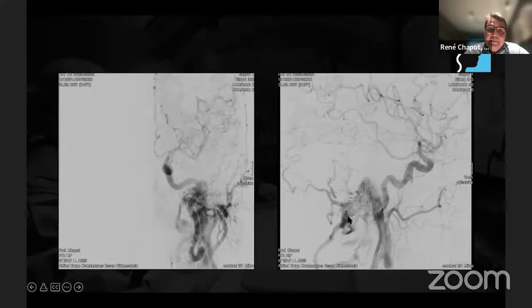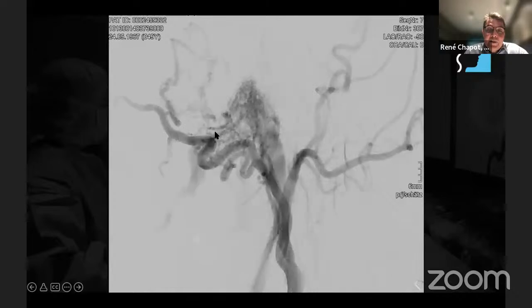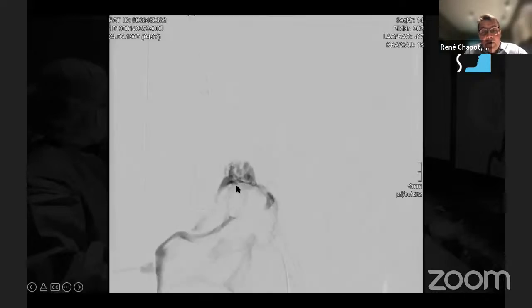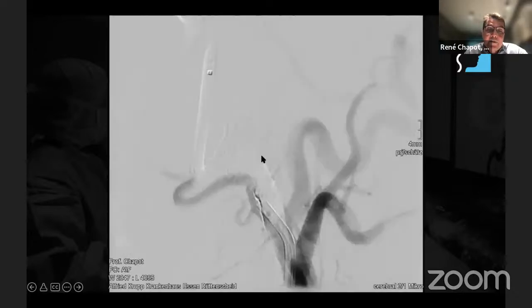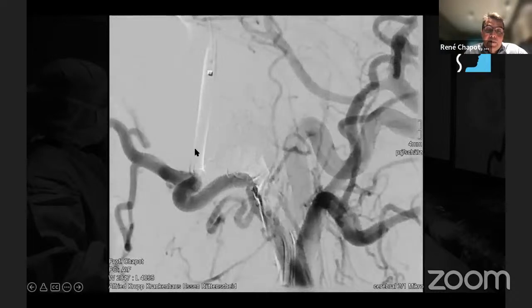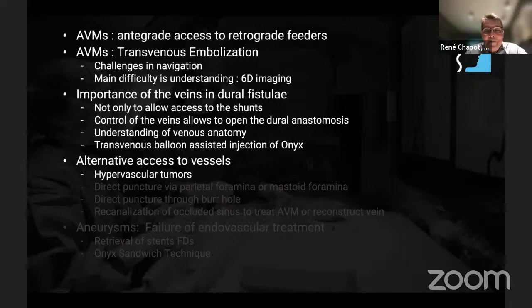And here, if we cannot embolize by the arteries, and if we don't want to occlude the sinus, because if there is no sinus on the other side, what we do is to place a balloon, it's a soft balloon, with some microcatheters being at the junction, trying to get retrogradely. But you see, we could not get so far away, but we block the vein. And by blocking the vein, we can inject retrogradely from the vein to the shunts, which enables to occlude the fistula. You see that the balloon is deflated, but not only to occlude the fistula, but to keep also the sinus patent. So the more we have tools, the more we can play with it.